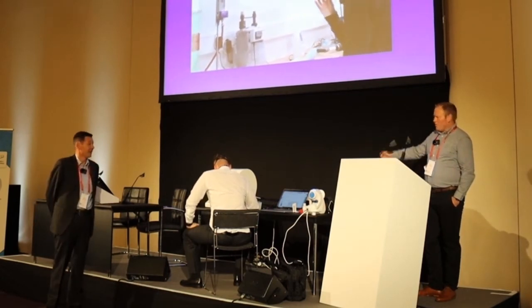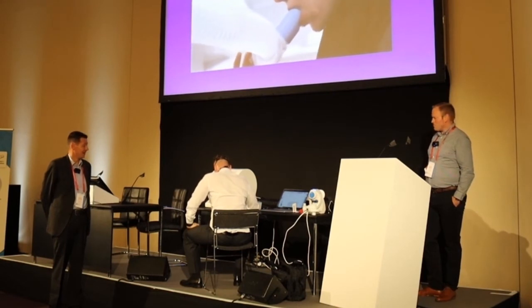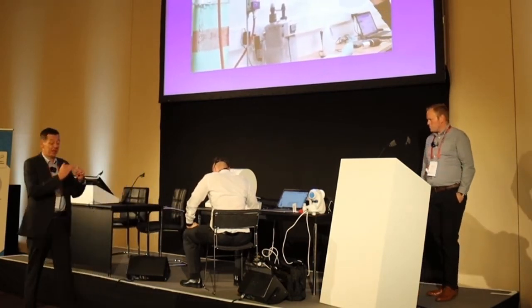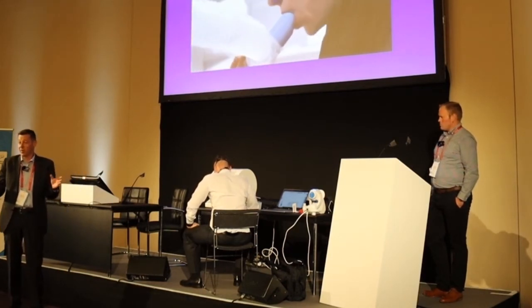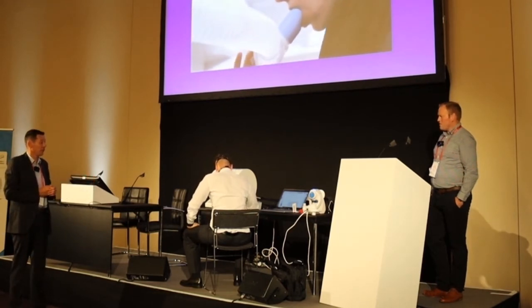So you can see he's kicked off. See, it's nice, deep, fast breathing. And you can even look at the screen. There's a small display where you can see graphically where your ventilation is at the moment, and you can expand the time as long as you want. Recommended up to 8 minutes. I think we do 5 or 6 minutes today.